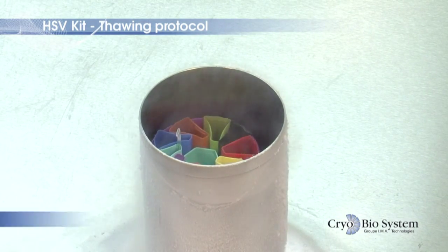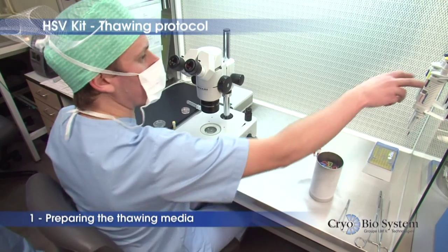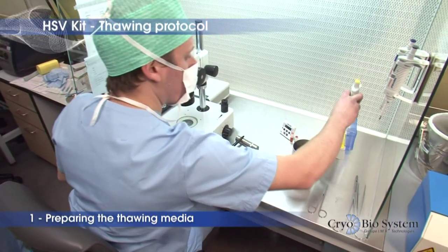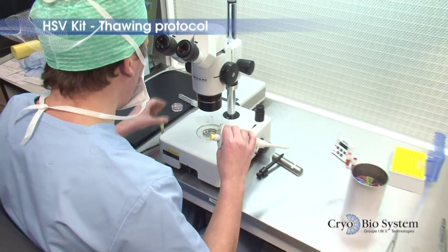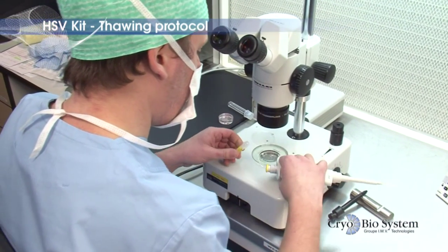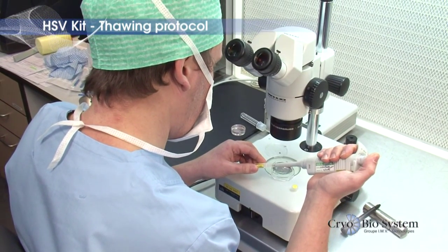Identify the HSV kit to retrieve and transfer it into a separate dewar filled with liquid nitrogen in proximity of a microscope. Prepare the thawing dilution solutions according to the instructions of the media manufacturer.